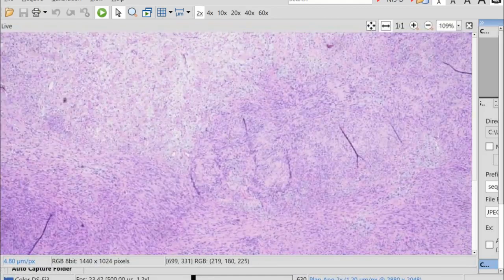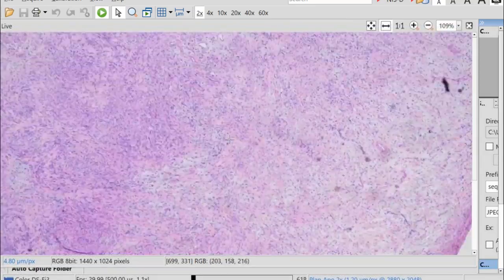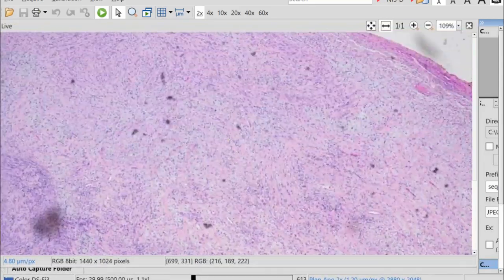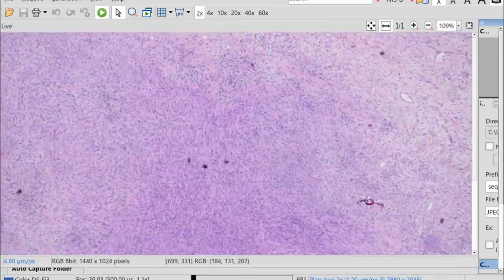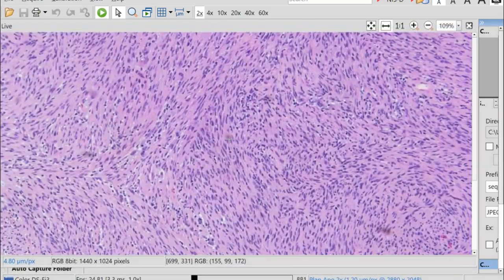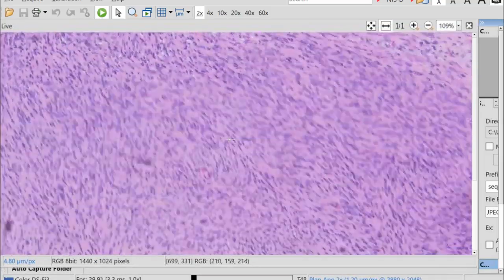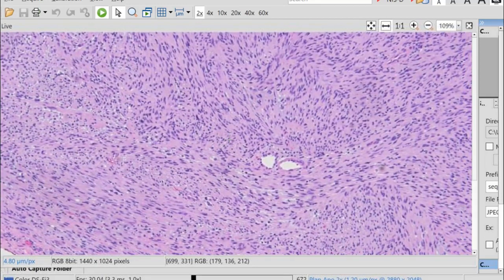And then in the nerve proper, in the nerve fascicle proper, they found that other proliferation that was intraoperatively a little bubbly, a little bit myxoid. They were concerned, I think, on imaging findings where it was a cyst. This one actually probably will qualify more as a cellular schwannoma component. So this was a very distinct, separate nodule.